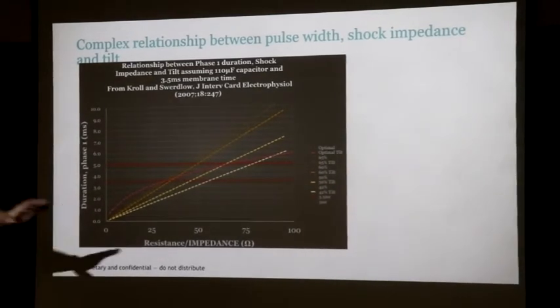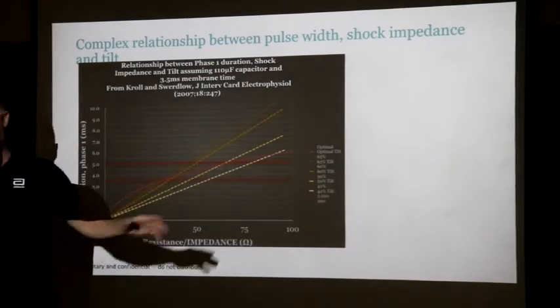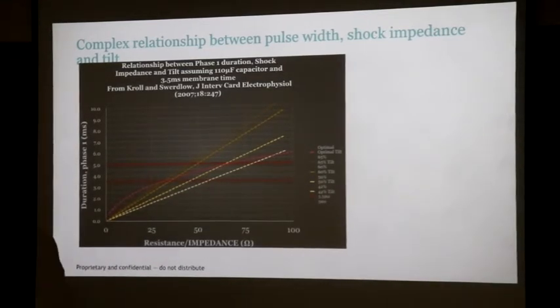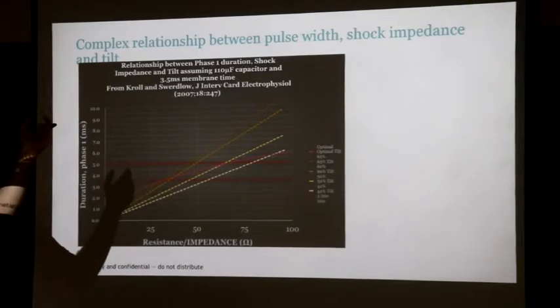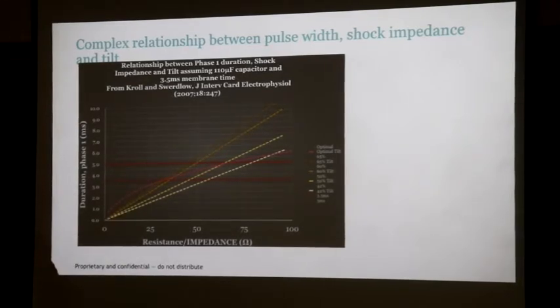So a lot of patients, if you deliver that shock at that duration, they're okay, right? They just have to have something, they might be on amiodarone, or it might be VF for minutes. So they have something that's nudged their DFT up. Most people's DFT is about 11 joules, right? But if you add amiodarone, a maturation effect, a bit of ischemia, whatever, it starts to nudge up and then it becomes a problem, right? It's a bit Swiss cheesy, right?